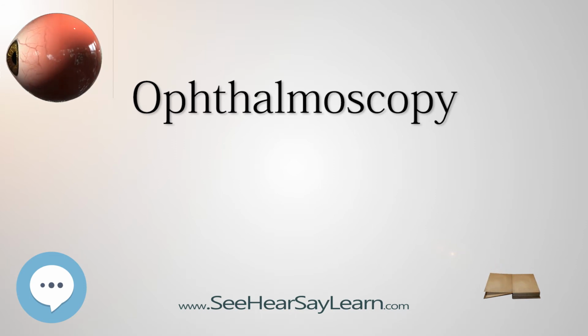In 1915, Francis A. Welch and William Noah Allen invented the world's first handheld direct illuminating ophthalmoscope, precursor to the device now used by clinicians around the world. This refinement and updating of von Helmholtz's invention enabled ophthalmoscopy to become one of the most ubiquitous medical screening techniques in the world today. The company Welch Allyn started as a result of this invention.